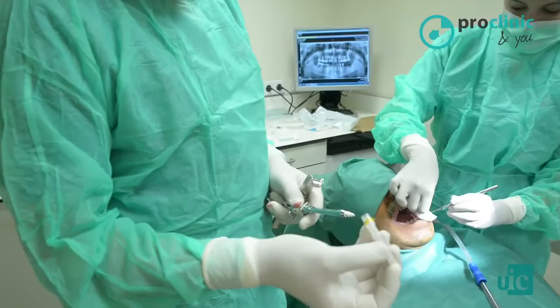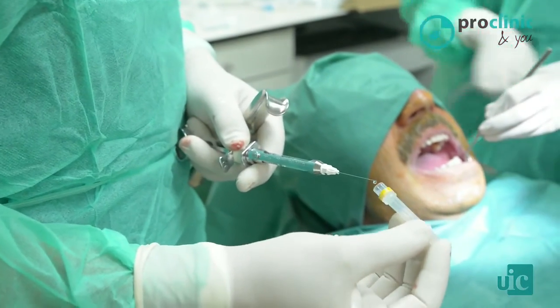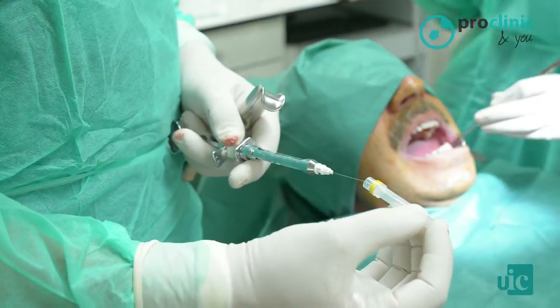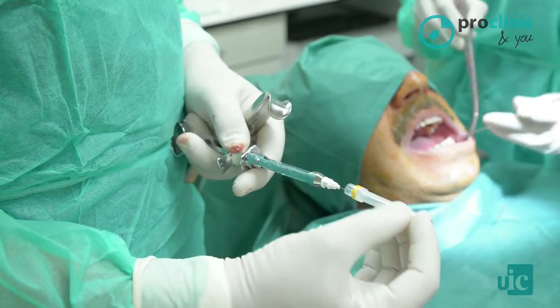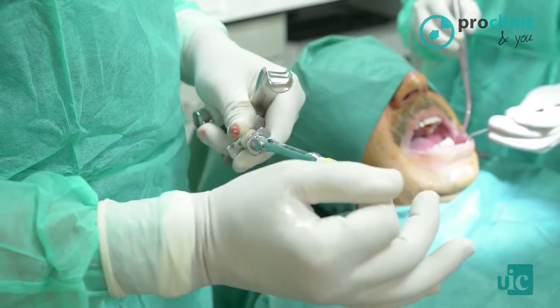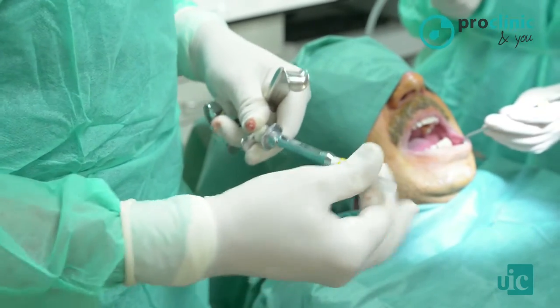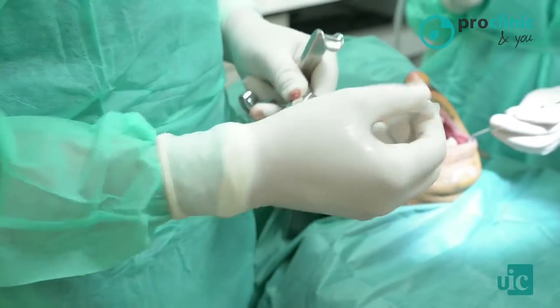After the puncture, we have to cover the needle with the cap to avoid accidents. It is very important to do it correctly, because the risk of self-damaging is high. We should do it with caution and with all our senses on the action.